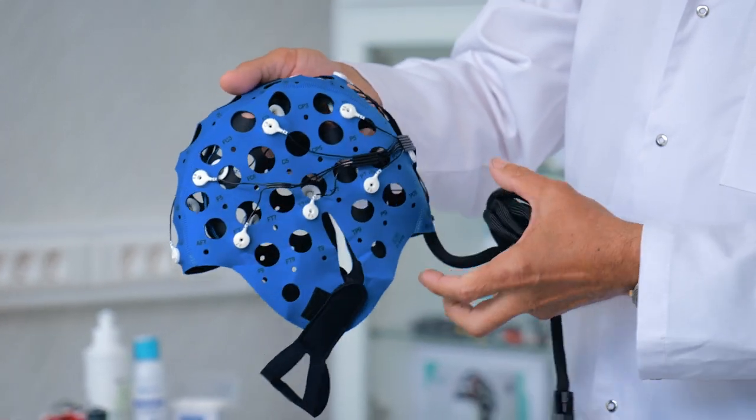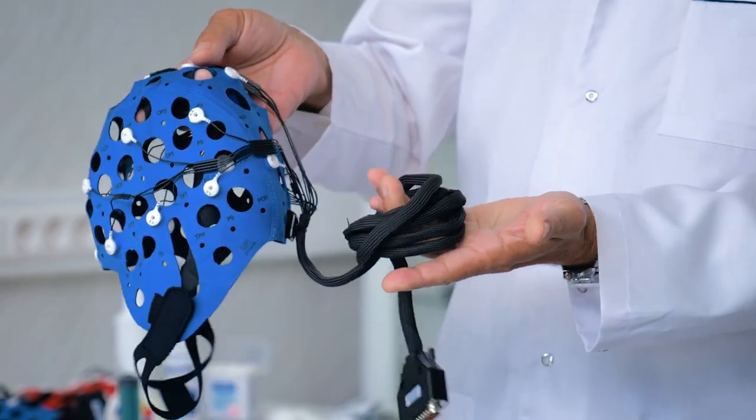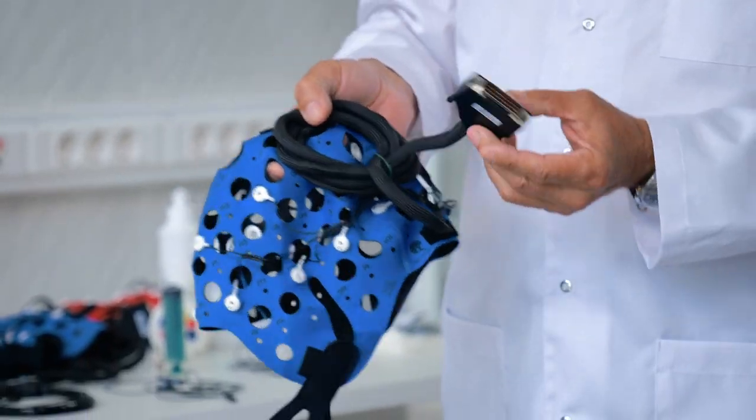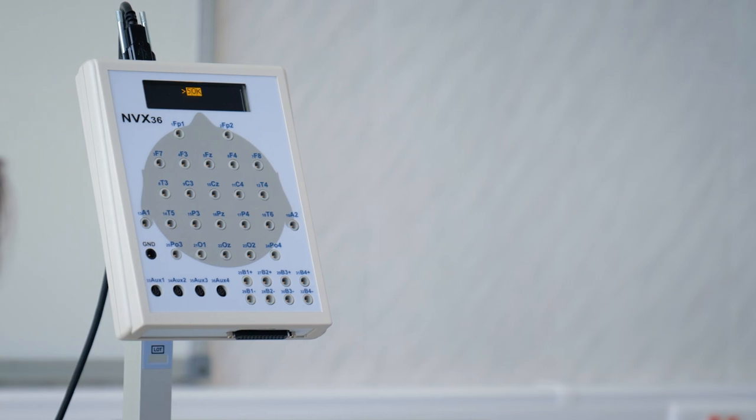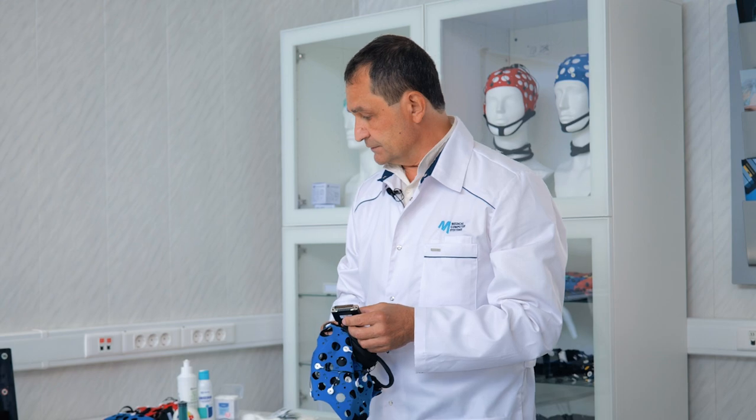All of the lead wires from each electrode are gathered into a single bundle which terminates with a connector. This common connector is linked to the input connector on the digital electroencephalograph, in the event that it is present on the device. Different manufacturers may have different connectors; accordingly, during production, the necessary mating part is installed as a common connector.